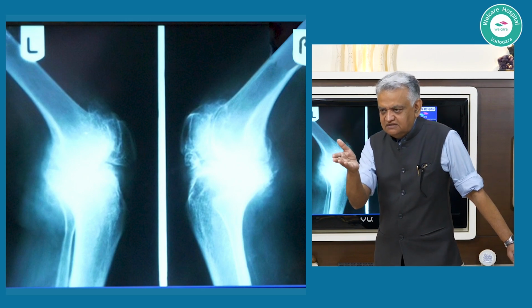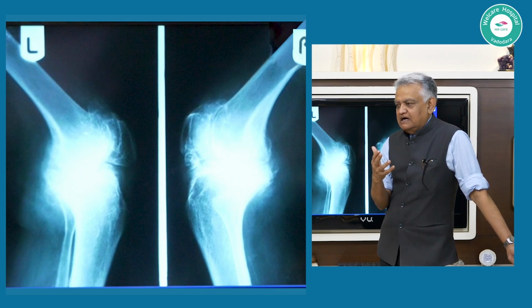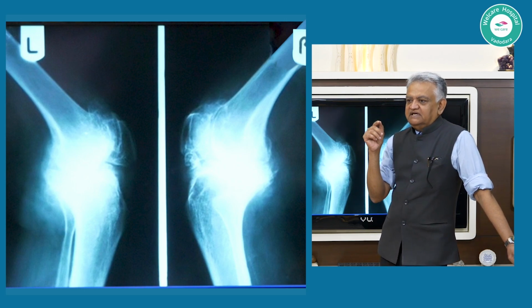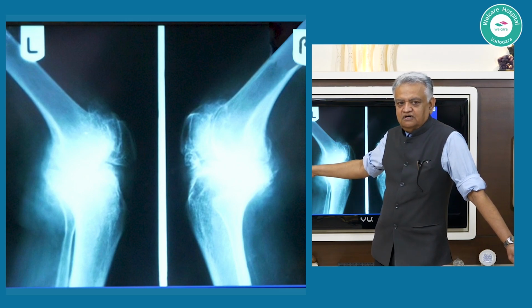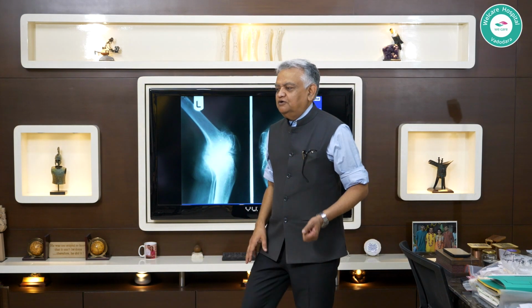And actually, what does a navigation or robot do? Unlike the human eye-mind thing, which is perceiving the anatomy as reality and the mechanical axis as a conceptual thing, the software of a navigation system does everything as a conceptual thing. There is nothing like that robot cannot come, or that navigation system cannot come and touch this. It cannot see the red color of the blood. It cannot see anything. For it, there are some points in space.